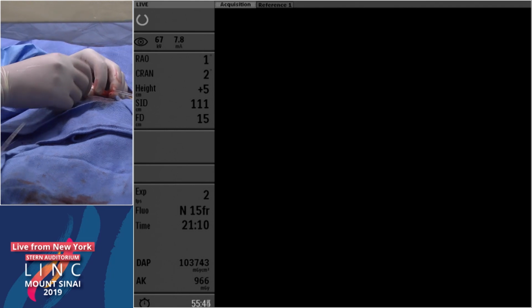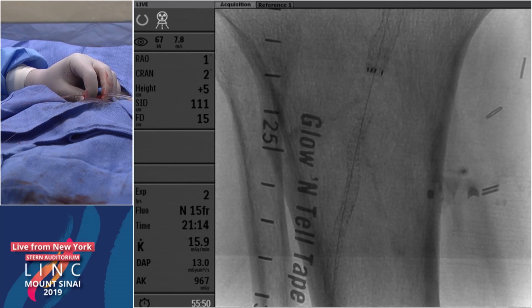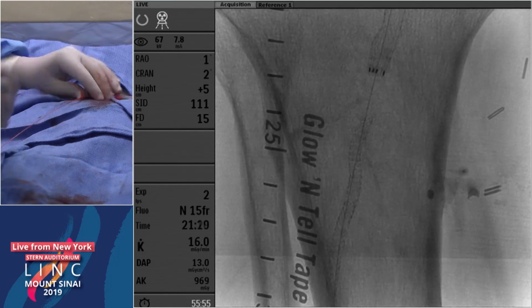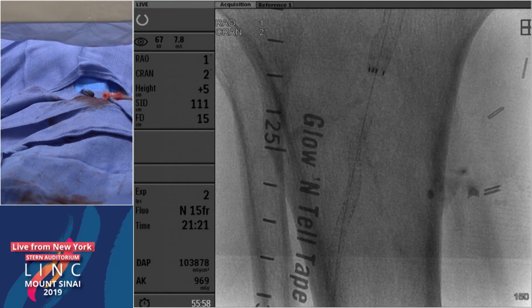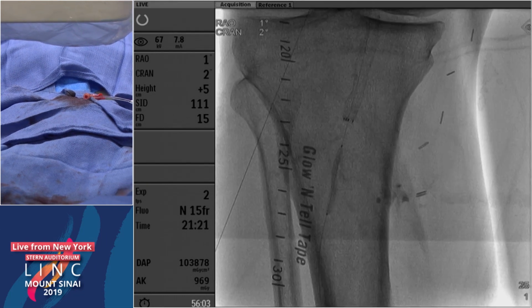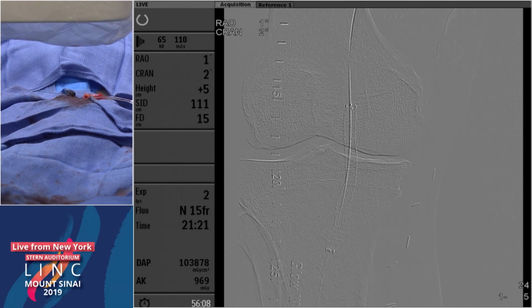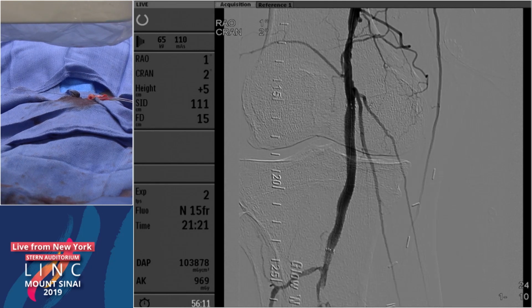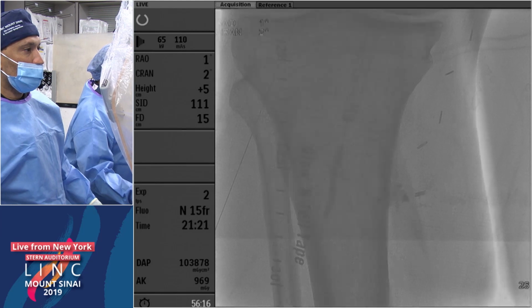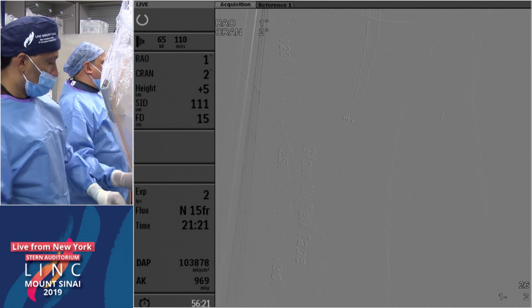Yeah, and I think the 4.0 is generally not too oversized for these proximal tibials, and so I have used that. Yeah, we have also, Fadi, used them. But in this particular case, when you saw the perforation, there seemed to be a dissection at the level of the ostium, and you showed that picture. And I think at that stage we felt that, like what Stephen was talking about, the peroneal is going to be the primary vessel. Minus one. There it is, right there. And then plus, go one more. We ballooned it and then took another picture. And you can see here that this was primarily the reason I felt that we should stent this.